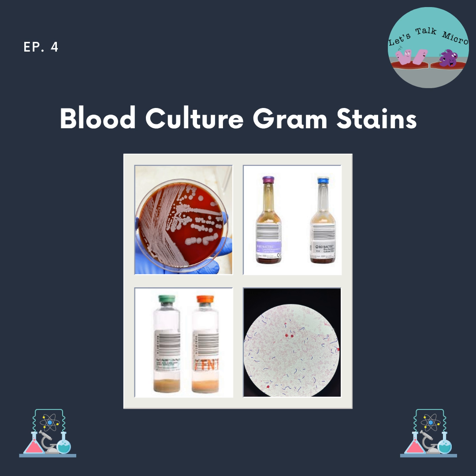Now, some of you must be thinking, well, wait a minute, you have two bottles. What if I see the same thing on both? I see gram-positive cocci in clusters on both the aerobic and anaerobic bottle. Do I have to make two phone calls? And the answer is no. If you see the same on both bottles, you only call it on the first one that's flagged as positive. Now, if you see something different, then you have to make a phone call. So you saw gram-positive cocci in clusters in your aerobic bottle, and then you see gram-positive cocci in chains in your anaerobic bottle, you have to make a phone call. Or if you see gram-positive rods, gram-negative rods, as long as it's different, you make that second phone call.